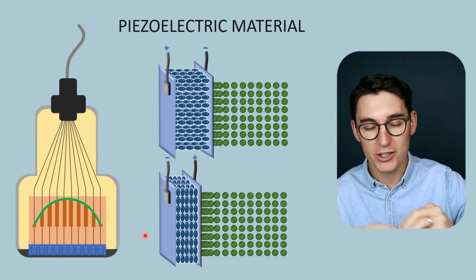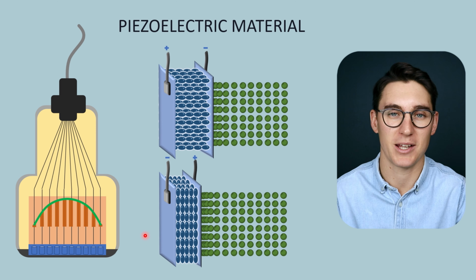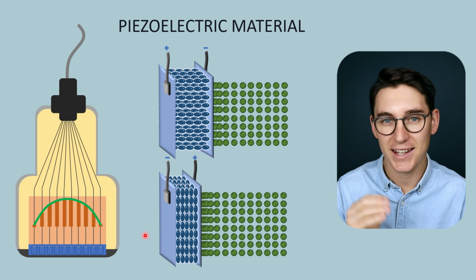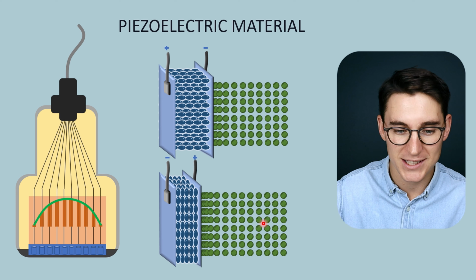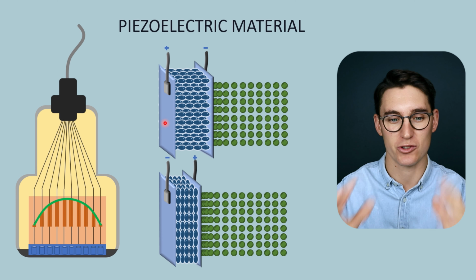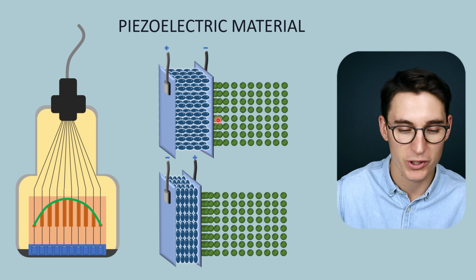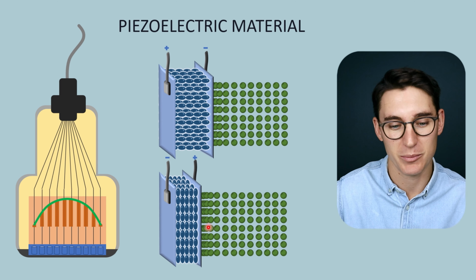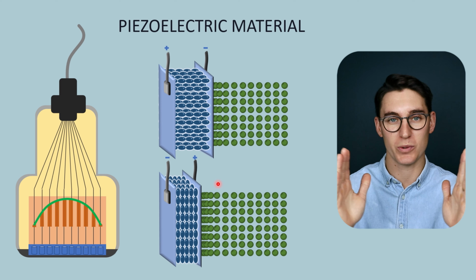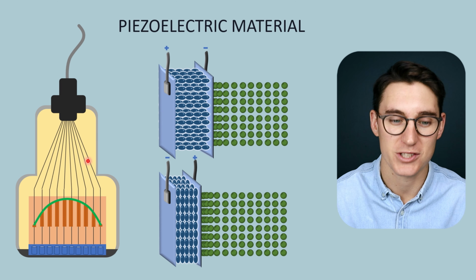Compression of that material will induce a current, and putting a current around that material will induce movement within that material. Now we are going to look specifically at this phenomenon known as the piezoelectric effect in a future talk. But for now, we can see that a sound wave heading towards our PZT material that is sandwiched between two electrodes can then compress that PZT material. So as this sound wave, this region of compression, comes towards our PZT material and compresses it like this, what will happen then is a current will be induced within that material, and an electronic signal will head back up the wiring towards our ultrasound machine.